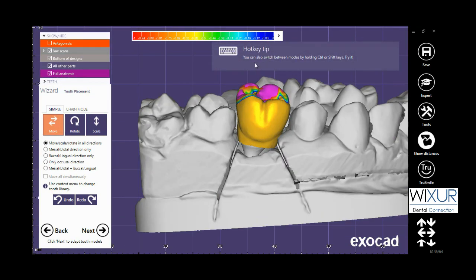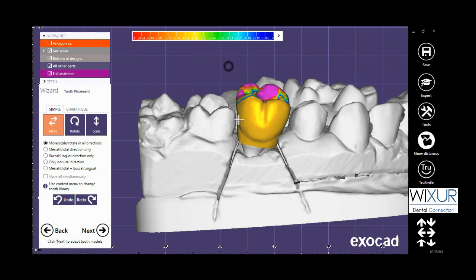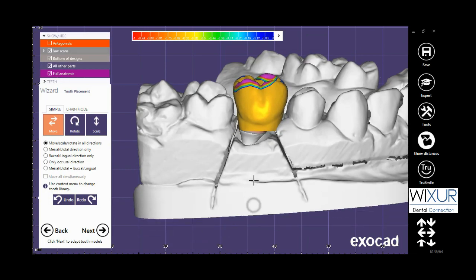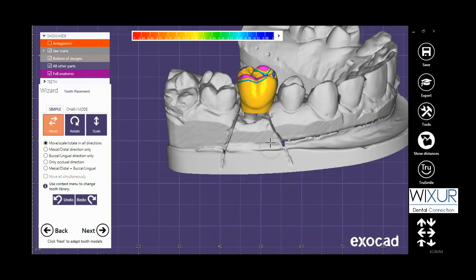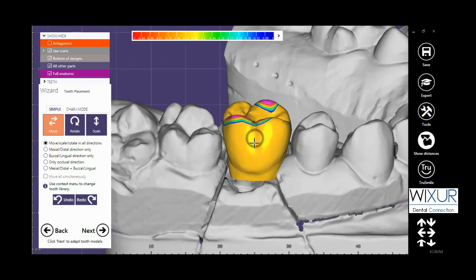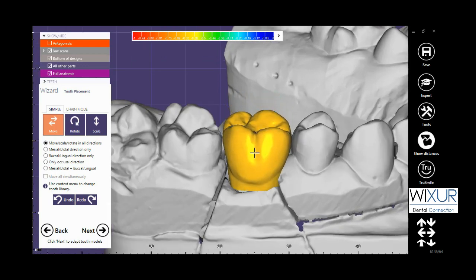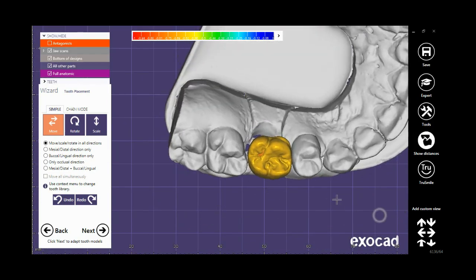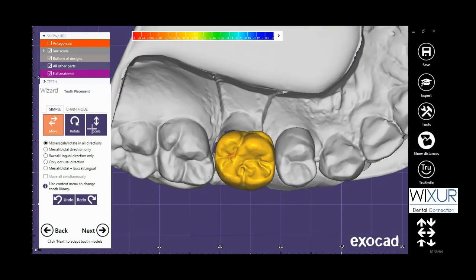As shown on the screen, a hotkeys tip comes up. Let's see how to use hotkeys in exocad. Don't forget that on the left, the move button should be selected.